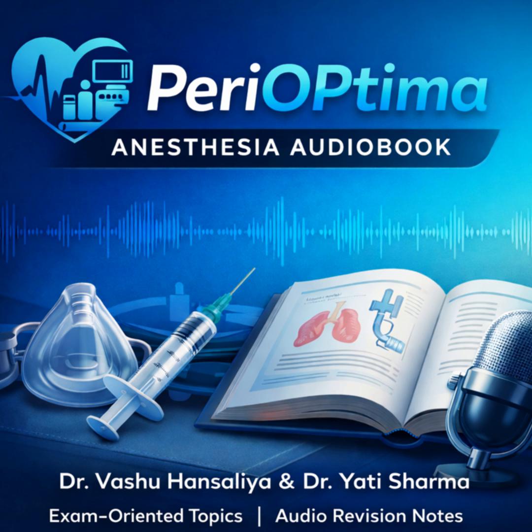Absolutely. The A-list examples here are the ProSeal LMA, or PLMA, the LMA Supreme, the Cuffless i-gel, the Laryngeal Tube Suction 2, or LTS2, and devices like the Ambu AuraGain. You need to know these names, their specific features, and exactly how they stack up in a comparison table.